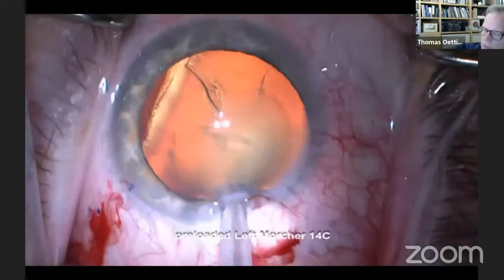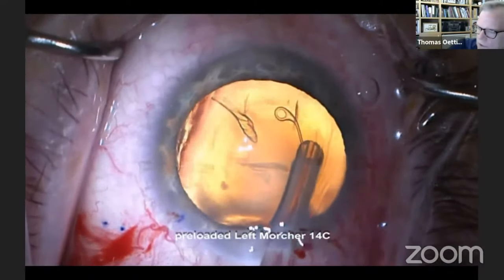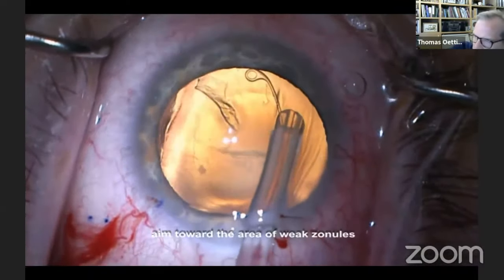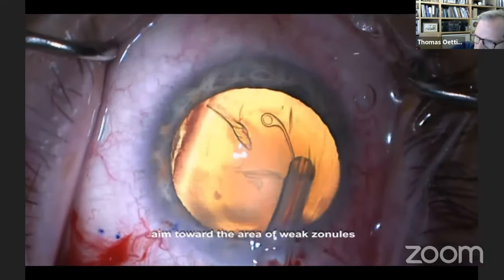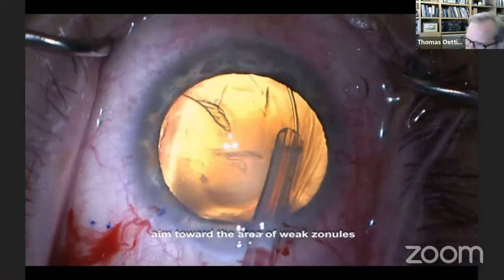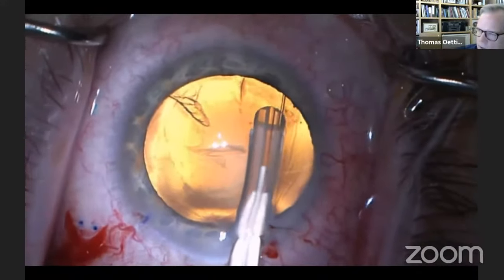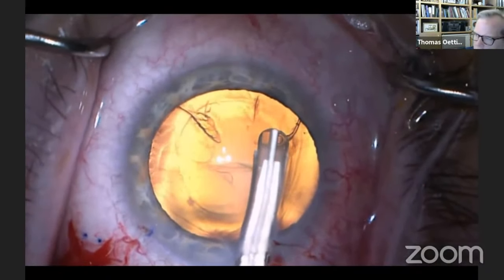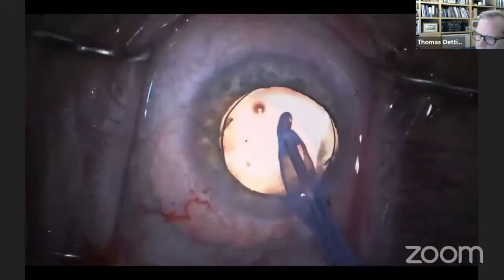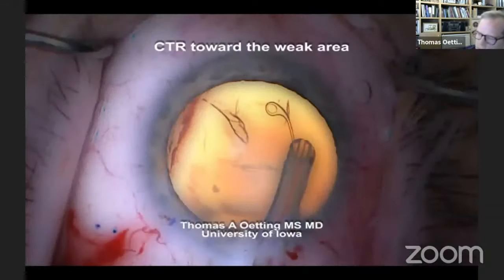And now we're going to go in with a left aimed capsular tension ring because the weak zonules are on the left side. We're getting just under the anterior capsule. Oh, not quite there. Make sure you're just under the anterior capsule. Lift up, use that dissected space, and place that capsular tension ring so that it doesn't trap any cortical material. And look how nicely it centers the lens. And really the rest of the case was relatively routine after early placement. You can see we put the haptics in the sulcus and the optic in the bag, and I'll talk about that in just a few more minutes. So that's the basic tips I wanted to show you for that.